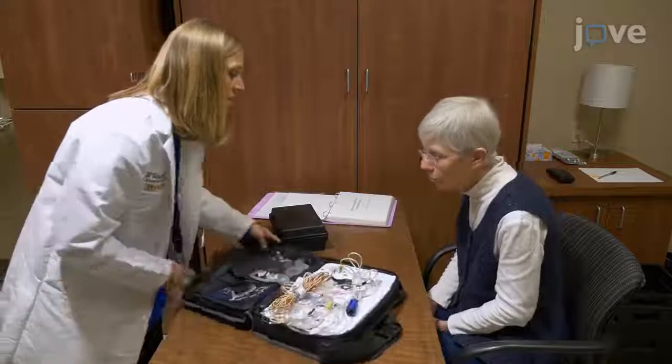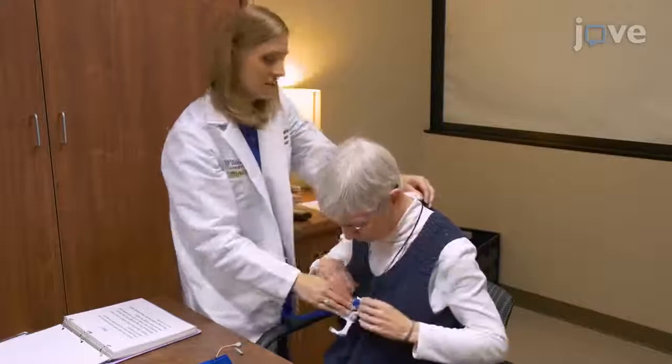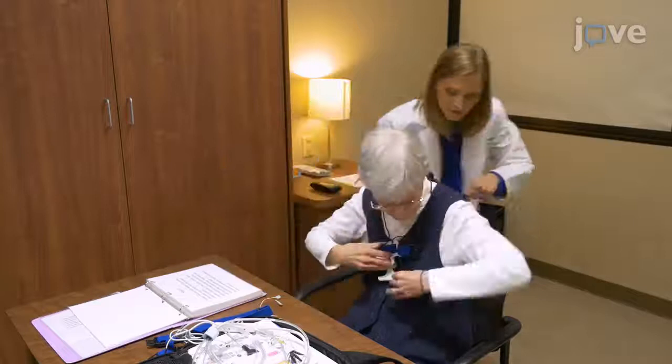Place the black lanyard strap around the neck and tighten until it is comfortably snug. Next, have the participant stand up and position the blue belt with the holster around the chest directly under the armpits, with the buckle almost centered.